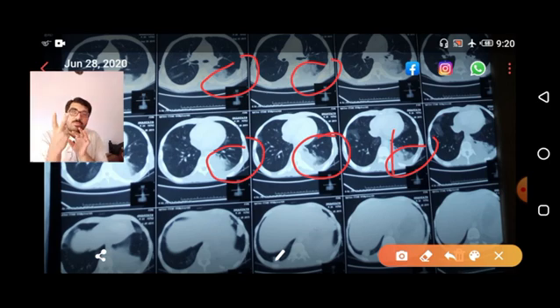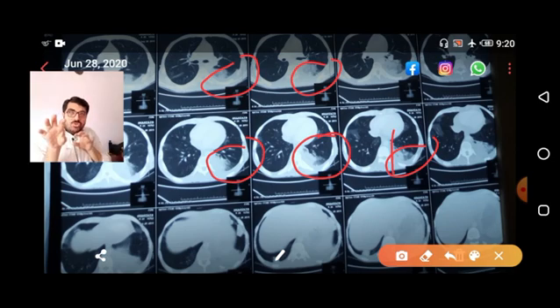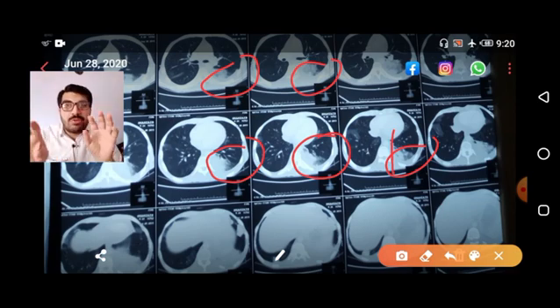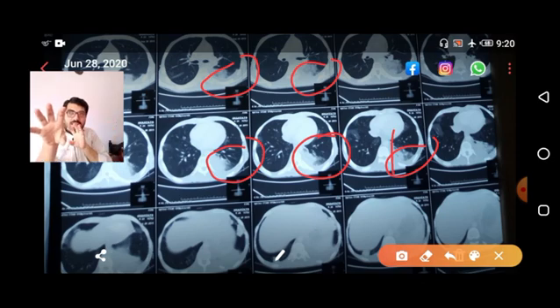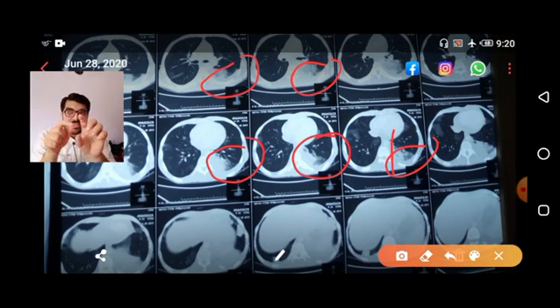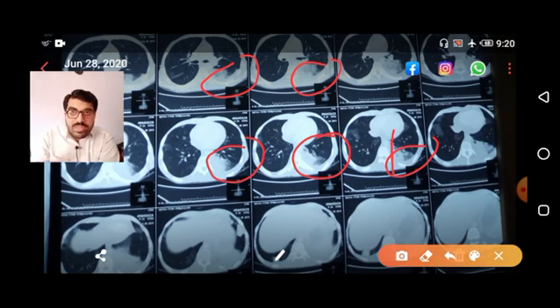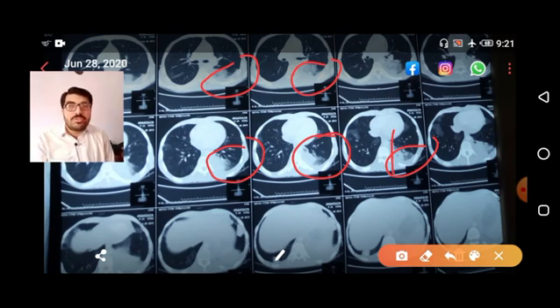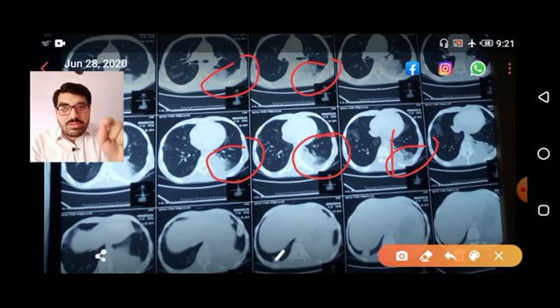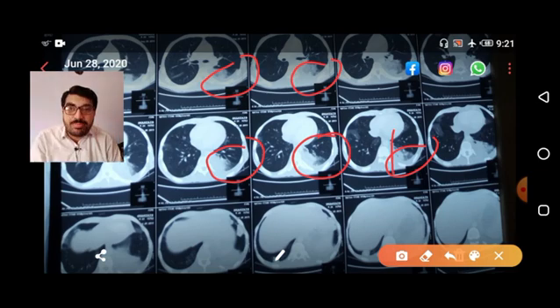X-ray is a two-dimensional conversion of three dimensions. If the opacity lies at the back of the hilum, the X-ray will show it at the level of the hilum. A lateral chest X-ray clarifies whether the opacity is at the front or back of the chest. This was a typical example of pneumonia with the focus confirmed at the back of the chest by CT. The X-ray showed left bulky hilum, and the patient had bronchial breathing at the back.